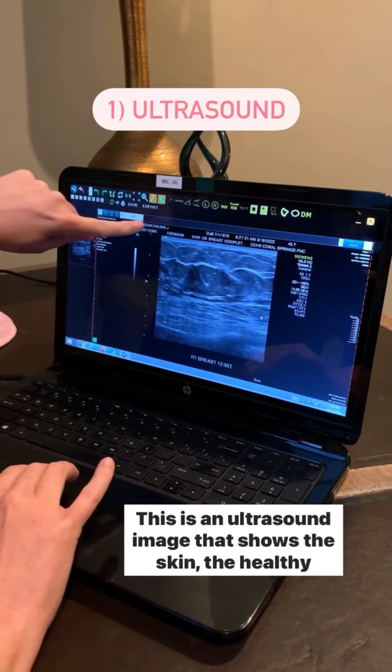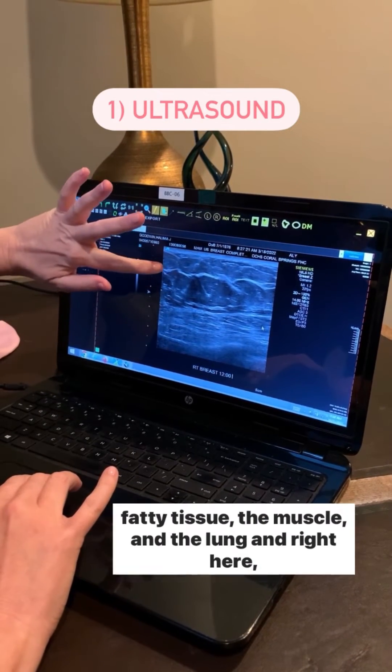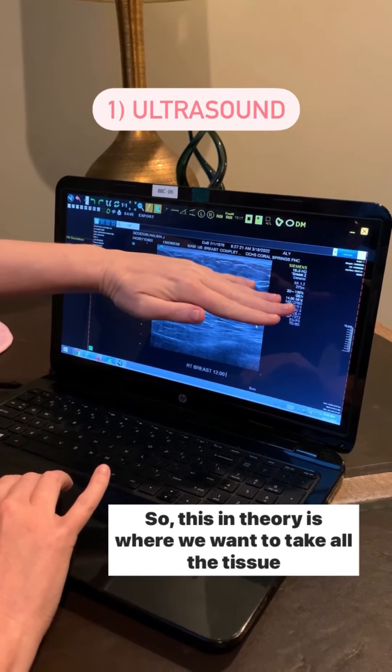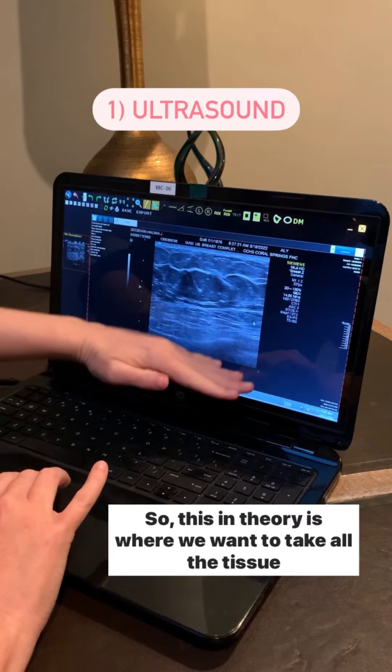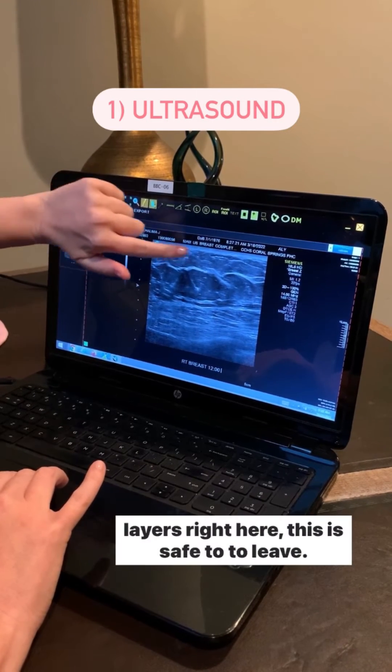This is an ultrasound image that shows the skin, the healthy fatty tissue, the muscle, and the lung. Right here there's a thin ribbon of breast gland tissue, so this in theory is where we want to take all the tissue down to the muscle — but this skin and this fat in these layers right here is safe to leave.